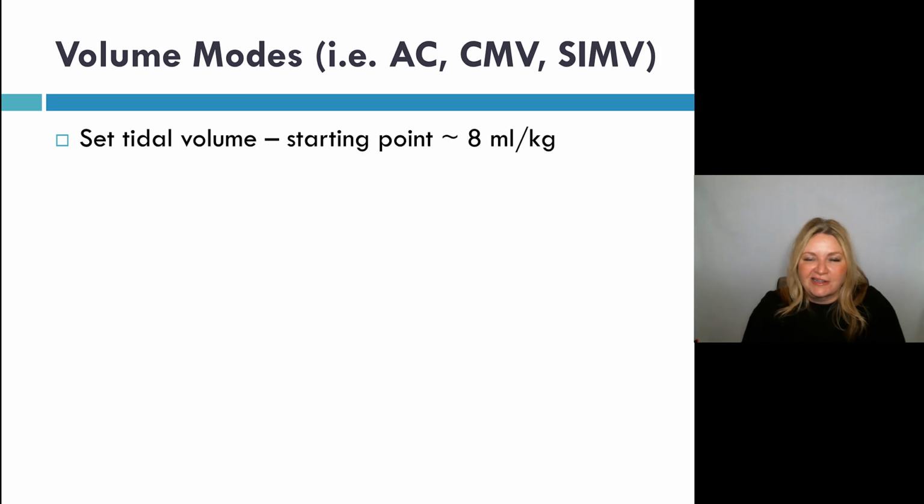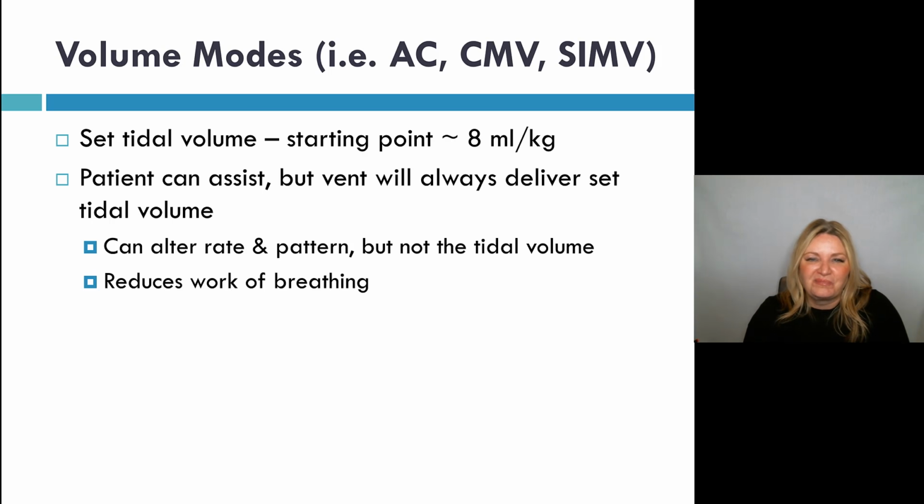I'm going to show you some charts that we commonly use to dose tidal volume. Now, in volume modes of ventilation, the patient can assist. Especially for example, with assist control, the patient can assist, but the ventilator will always deliver that set tidal volume.